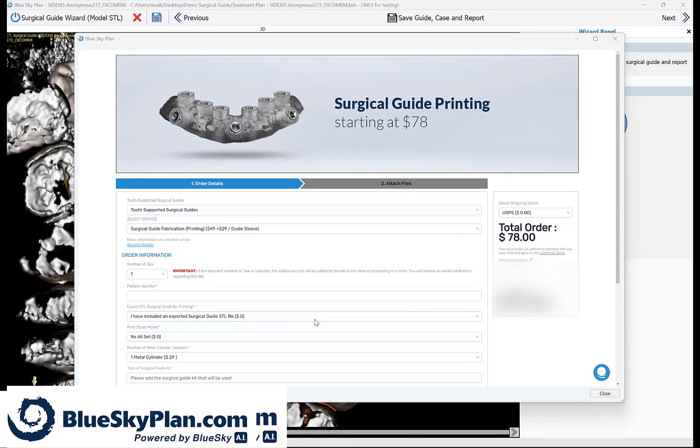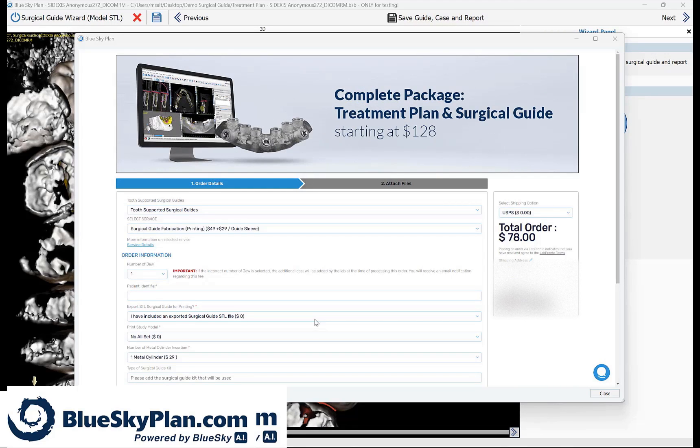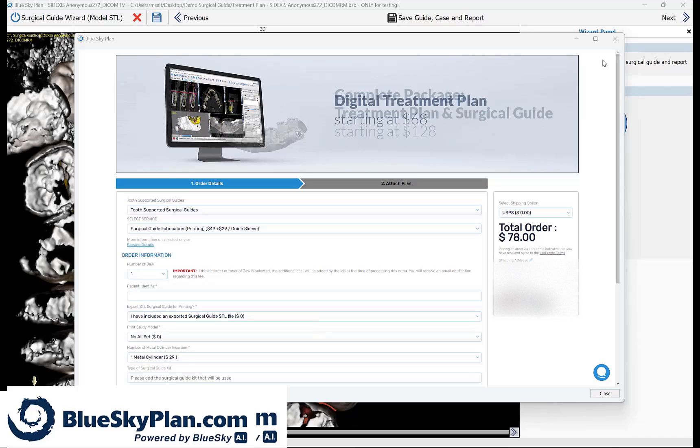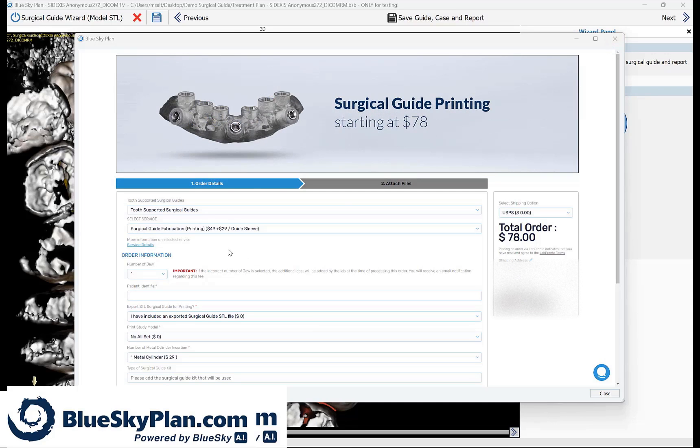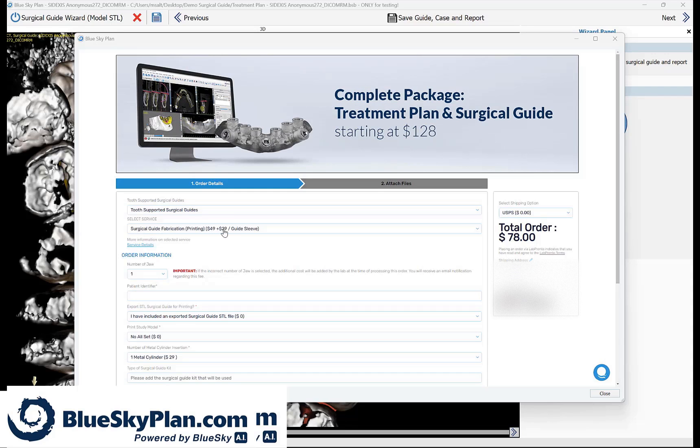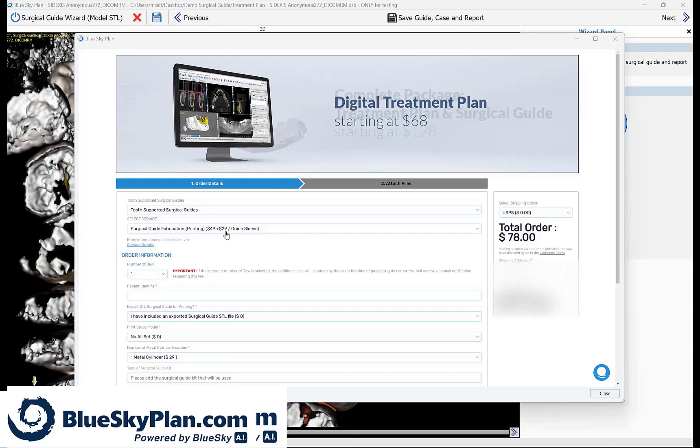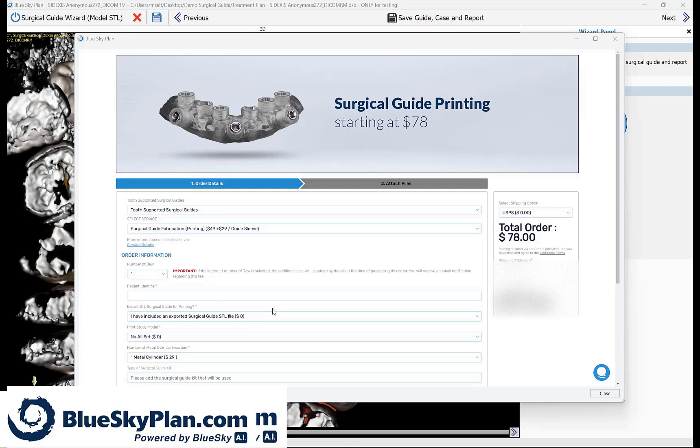So what opens on your screen now is a lab prompt order form. If you are going to be manufacturing the surgical guide, printing the surgical guide in-house, just go ahead and exit out and close it. If you would like to place the order for the surgical guide to be fabricated, you could do so at $49 plus $29 an implant. Go ahead and complete the order form and submit the order.